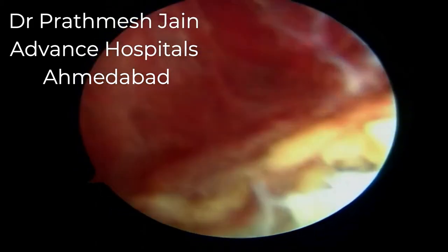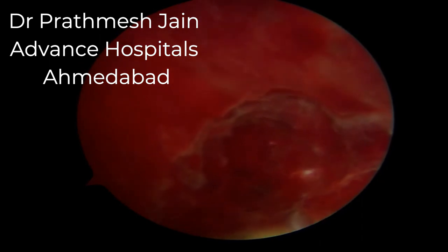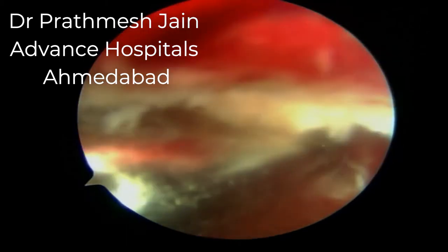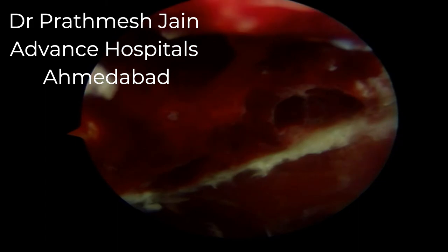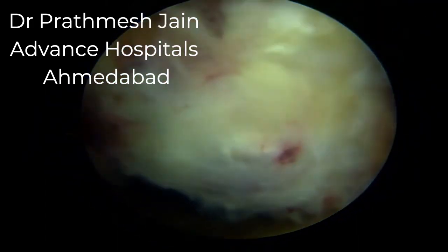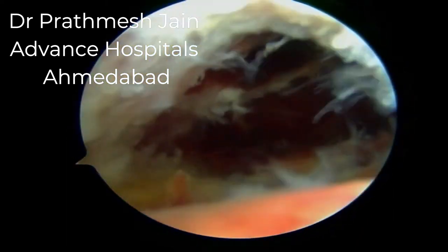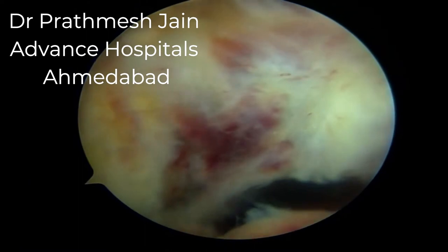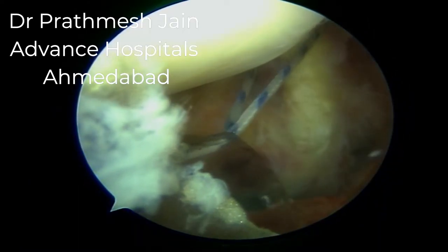Here we can appreciate the bony bed from which the PCL avulsion has taken place. We need to prepare this bony bed using small curettes and shaver blades to remove the clot from this area. We clean this area thoroughly because we want the PCL avulsion fragment to sit back in its original place. Once the bed is prepared, we are ready to tie the knot.